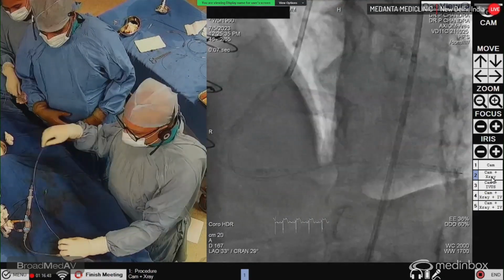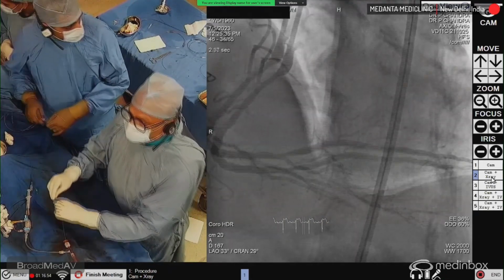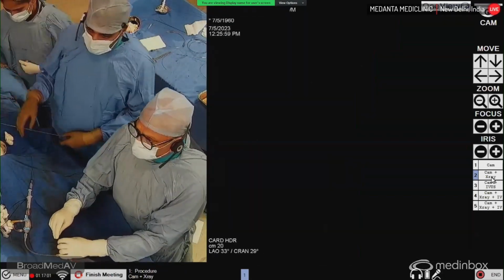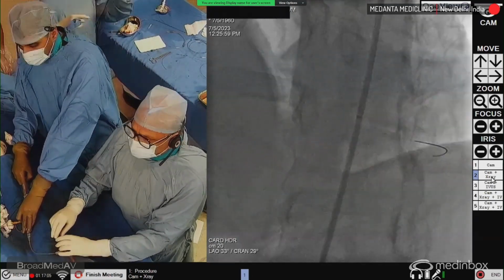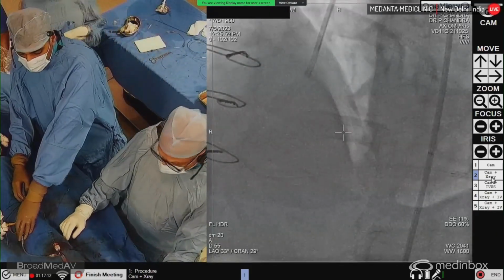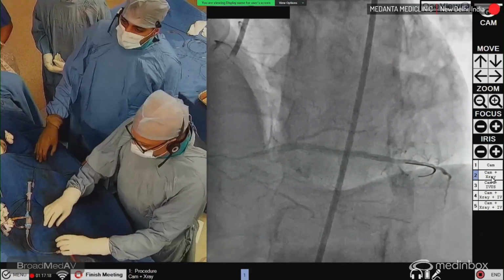This looks fine. I think to me, we are absolutely okay now. So with this, I think we are at the end of this long procedure with 3 vessels done. And as it is very clear now, with these kinds of situations, using a laser was quite useful in a tight lesion where you cannot put a distal protection up front. Let's take a final shot. Yeah, that's nice.